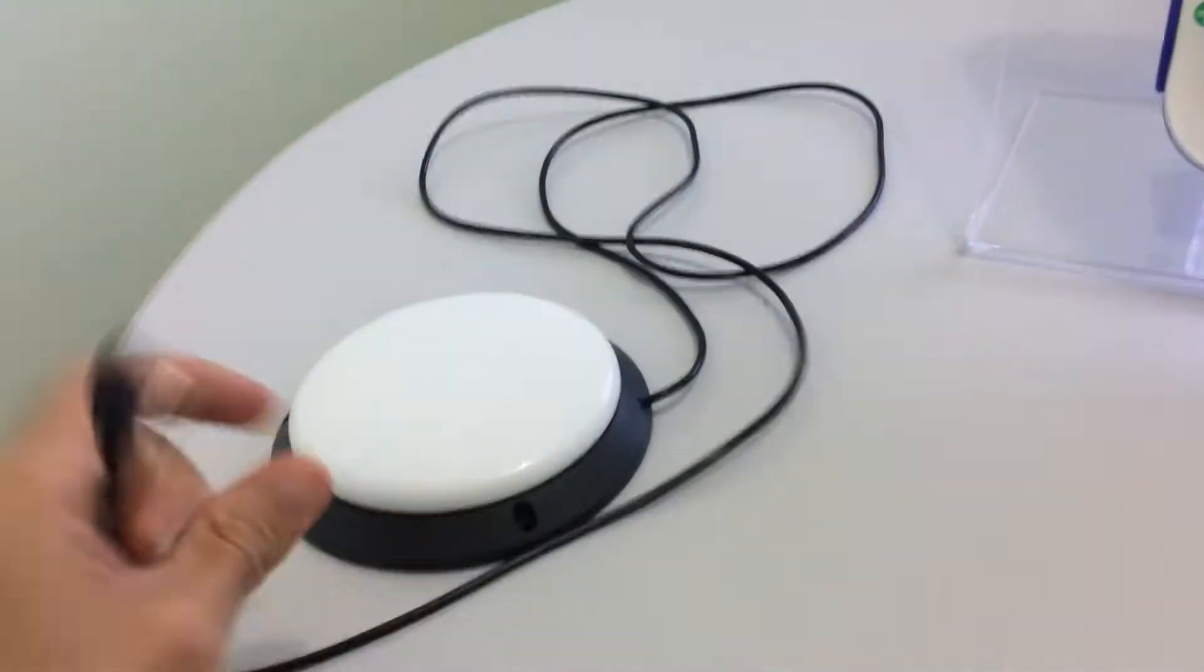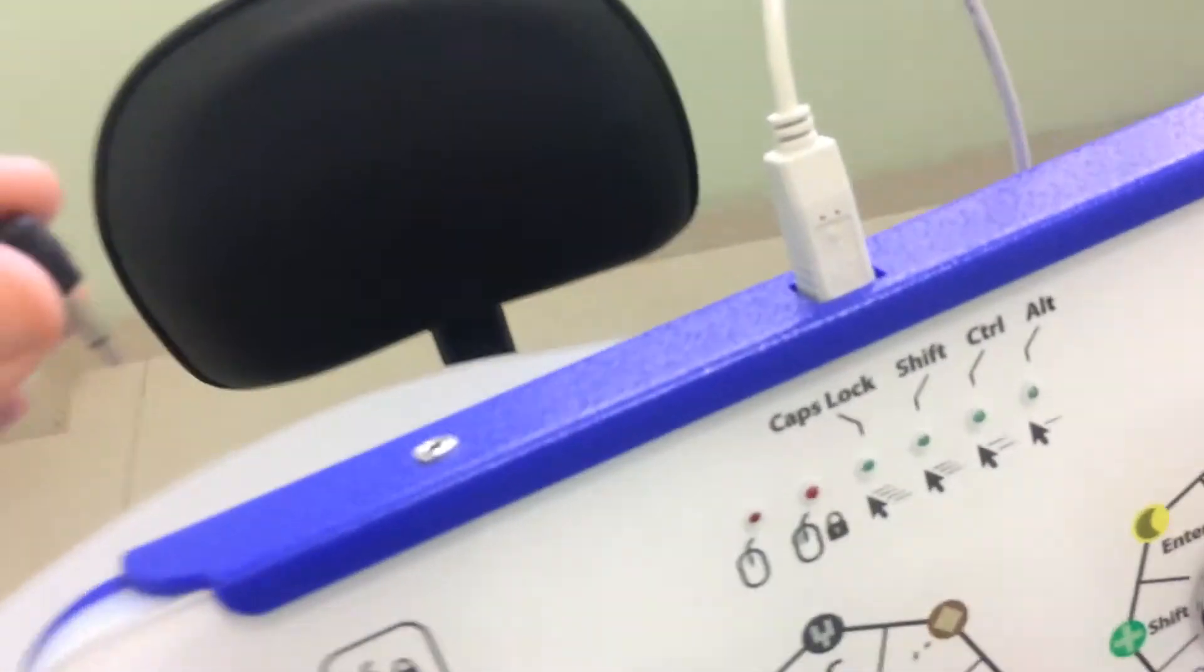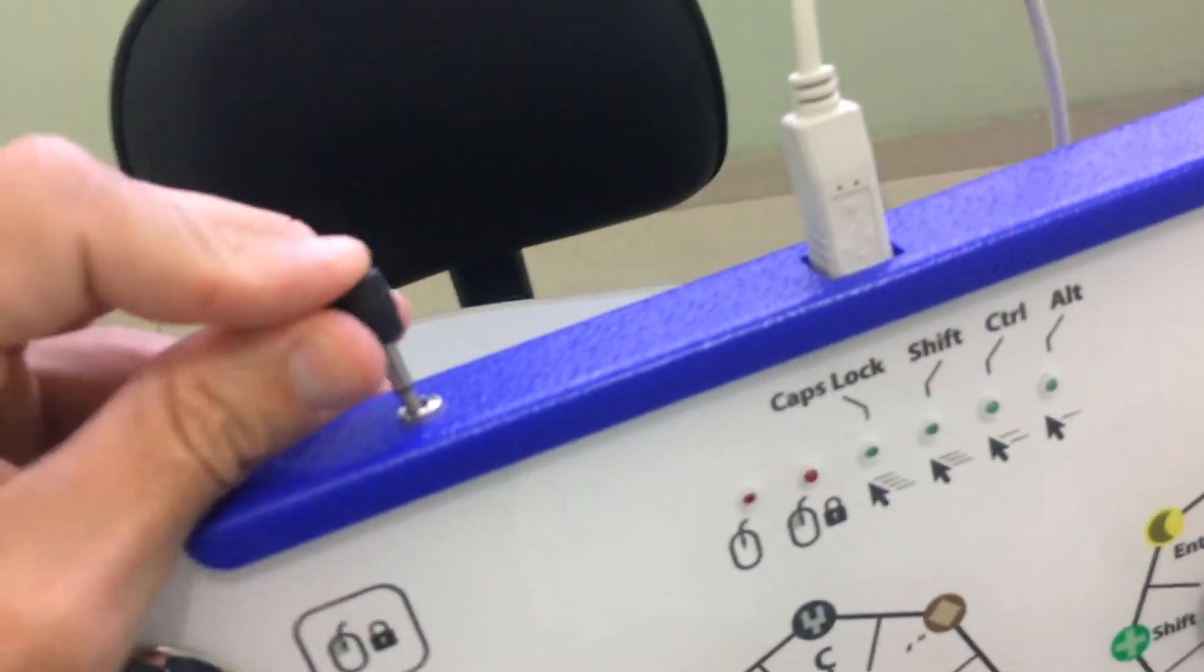In this example, we are going to use a regular switch button. You just have to plug it in its connector at the upper side of the KEYX.